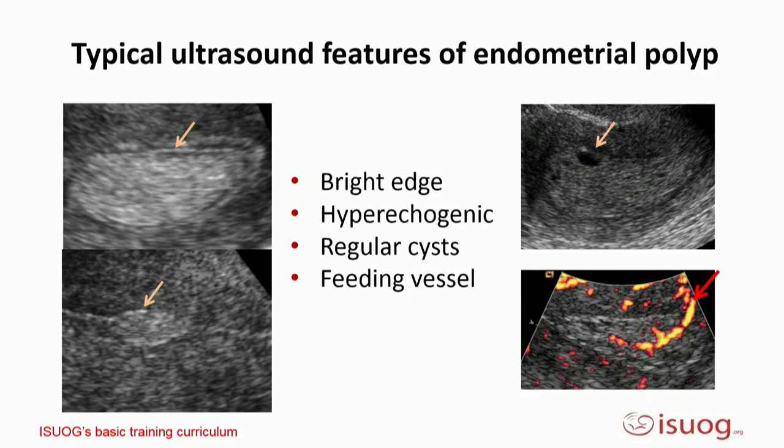I think we can have a last question from the online satellite courses. A question from Brazil: is there any limit for wall asymmetry for adenomyosis? No, it's completely based on your subjective evaluation, actually.